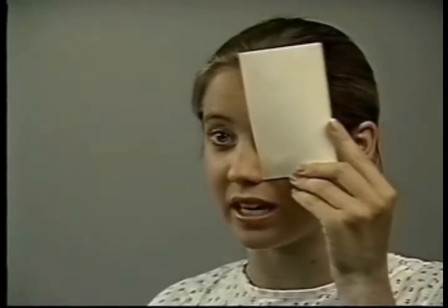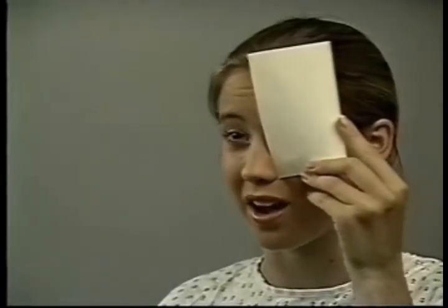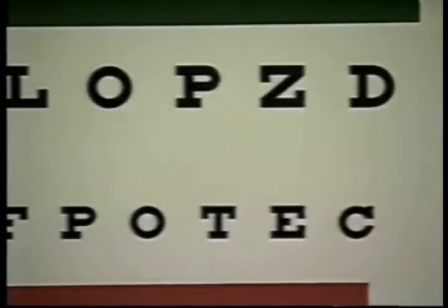Note the visual acuity printed at the side of the line of the eye chart. Now I'd like you to try to read the next line. Then repeat the test on the other eye. Remember to record visual acuity using two numbers, such as 20/20, which is normal.